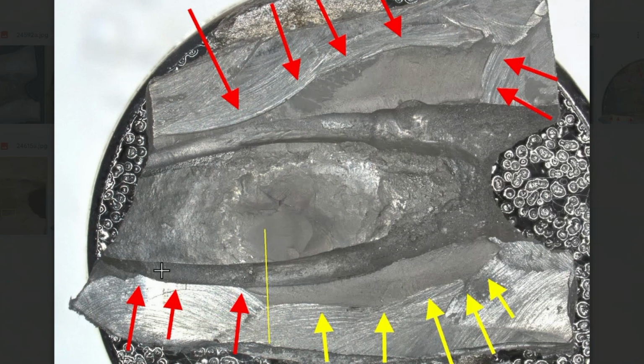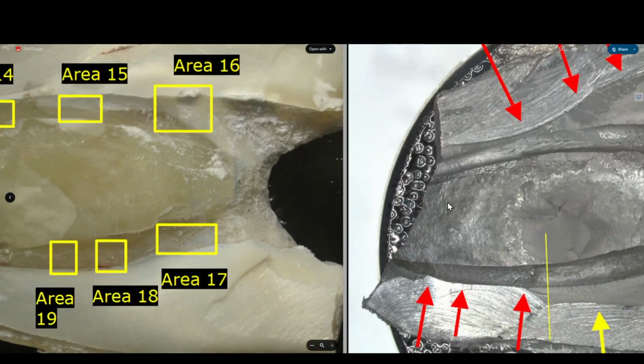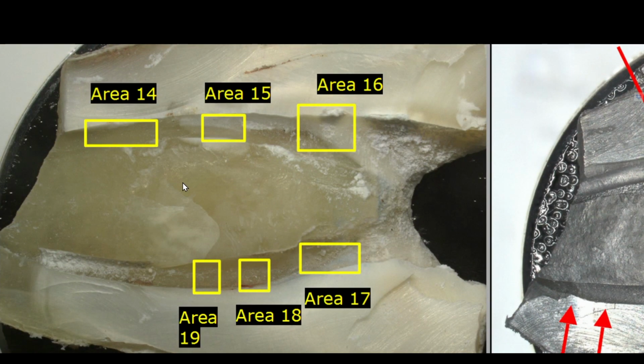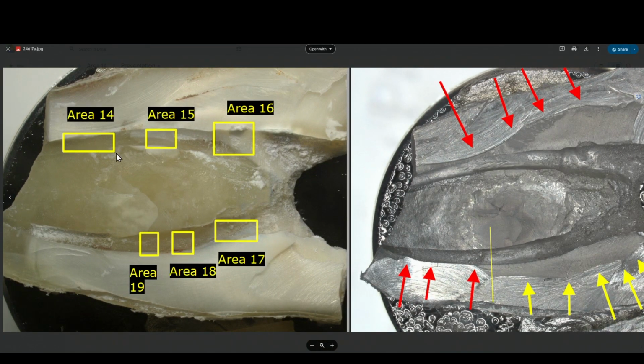Last time we looked at this as an example during the prologue. So this is how I chose the areas based on this sputter-coated section. In this section, we're going to look at area 14 and see how this virgin canal that was instrumented by Reed, and where the Gentle Wave was used, looks. It'll probably give us a fairly accurate picture of what the device is capable of.